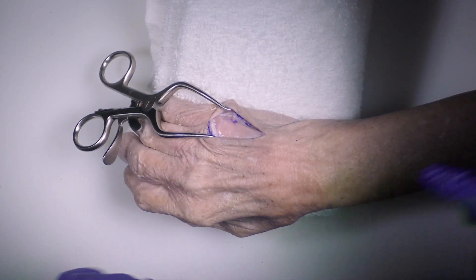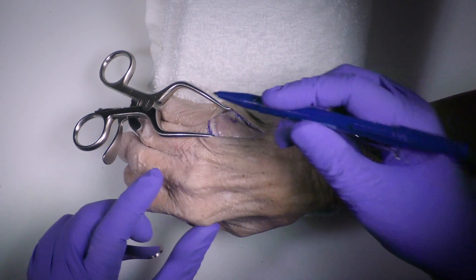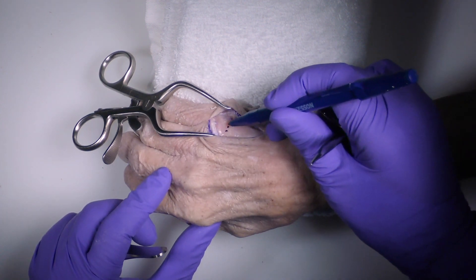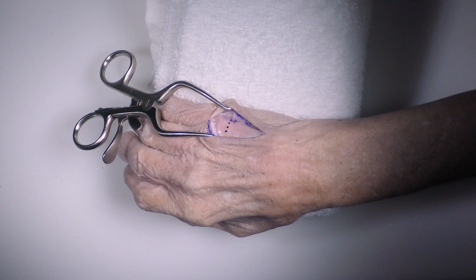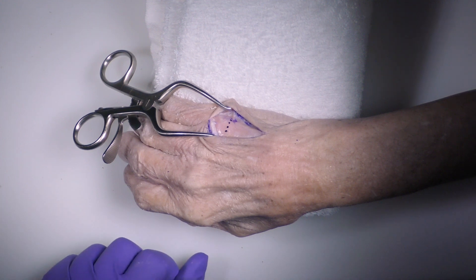So typically here, you'll see your fracture line. I'll just kind of mark it out. Generally, you'll see it right about this area here. That's typically where the fracture line for metacarpal neck, aka boxers, fracture is going to live.